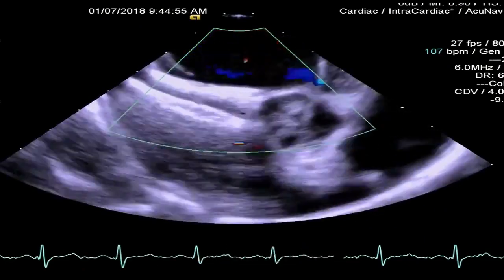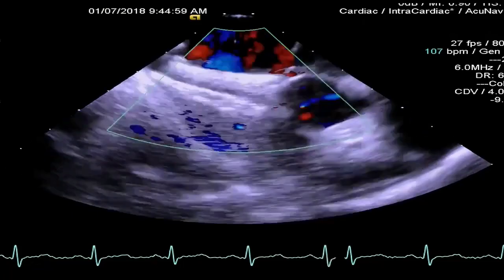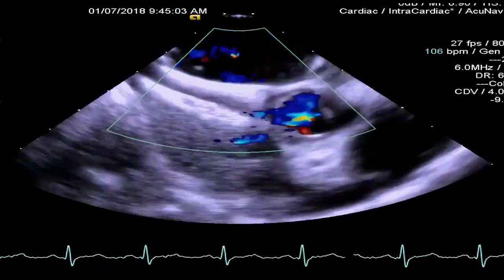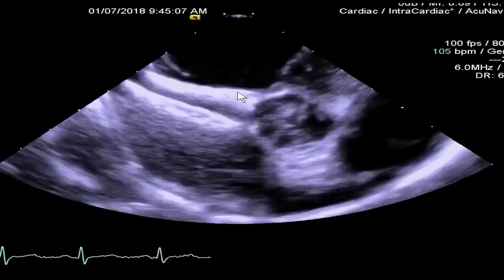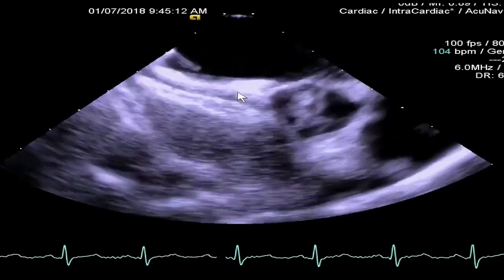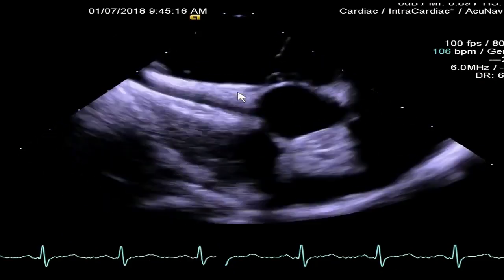Any other questions about intracardiac echo? And then Dr. Avinash will be doing the Minnesota wiggle. Pictures look really good, but how much does intracardiac echo add to the cost to the patient? The cost, currently the cost of each intracardiac echo catheter is about 170,000 rupees.